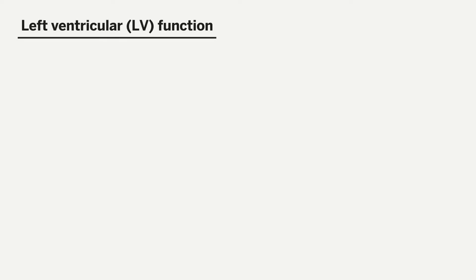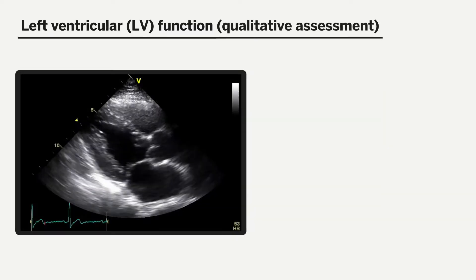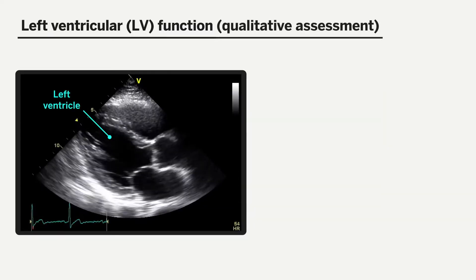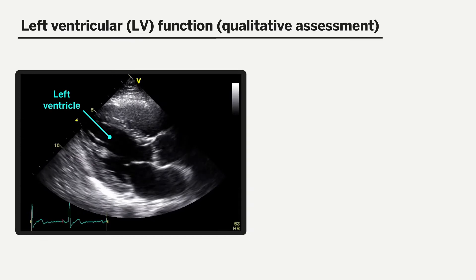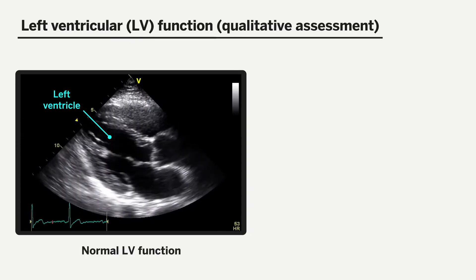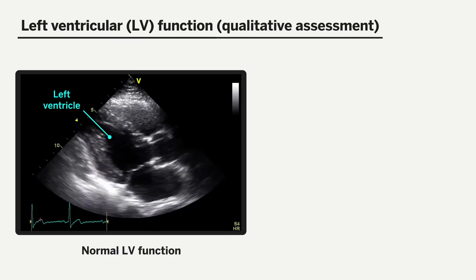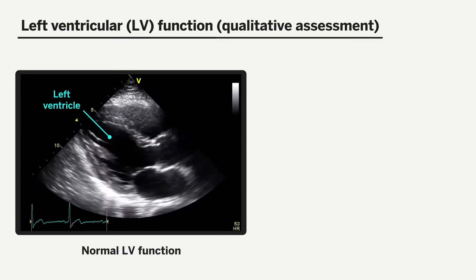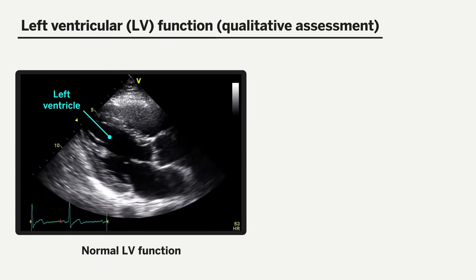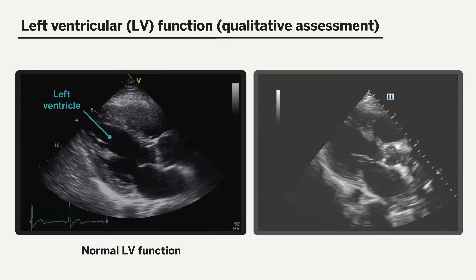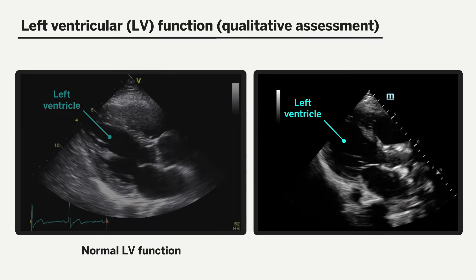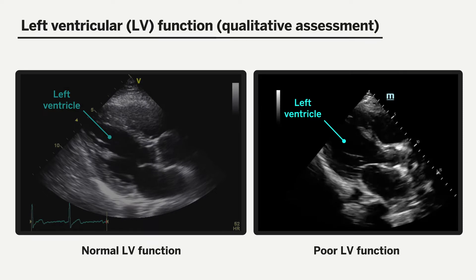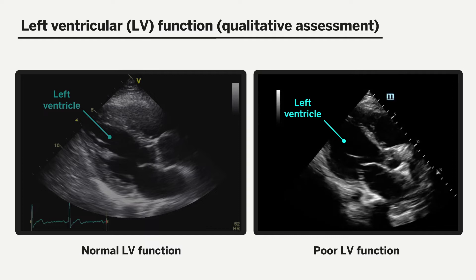Left ventricular assessment can be performed in this view both qualitatively and quantitatively. Qualitatively, left ventricular function can be eyeballed, where good left ventricular contractility can be seen visually, suggesting good function as displayed in the video loop on the left. Poor contractility can also be appreciated, indicating poor left ventricular function, as displayed in the video loop on the right.